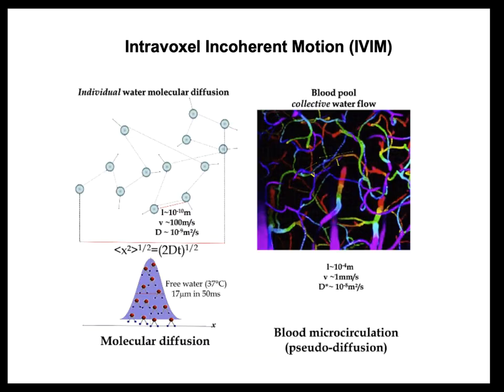So the basic idea is this: when you apply diffusion weighting gradients to do diffusion imaging, you're applying basically a bipolar pulse, or two unipolar pulses around a 180. And what it does is any spins that are moving in position experience a different magnetic field, and they quickly become out of phase with other spins. And so depending on how sharp of a gradient you have in terms of the magnetic field, you are sensitized to different velocities of spin diffusion, or different degrees of spin diffusion. So if you have a really shallow gradient, spins will have to diffuse pretty far to become dephased. So you're sensitive to very rapidly flowing or moving protons.